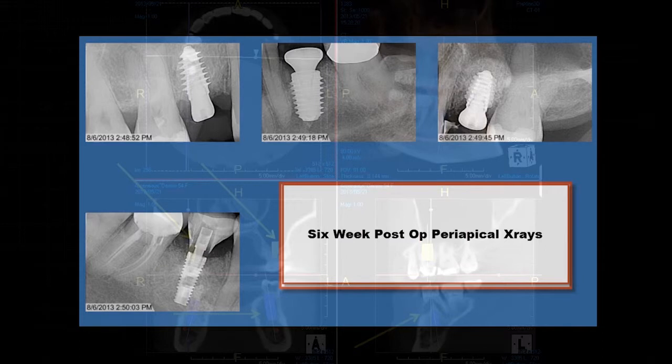You see we've done a sinus lift here, sinus lift here. These were placed at the same time. You see we used a large diameter implant on the lower left side because the bone is not very dense in here, and when you get in there, it feels just like this looks. There's just not much density there. So we're going to use something that's wider in diameter that engages the buccal and lingual cortices, so we get better primary stabilization that way. In the lower right side, a tapered screw vent implant.